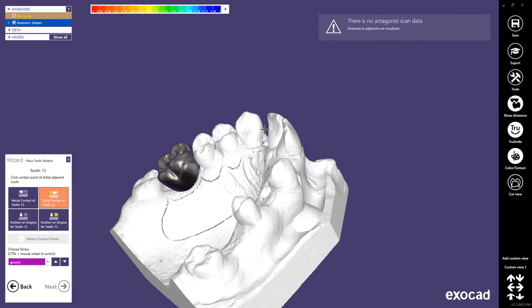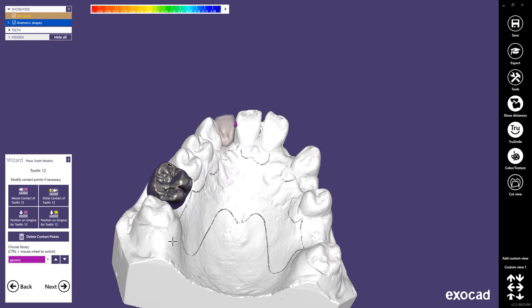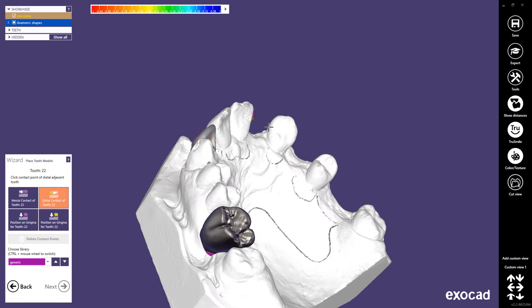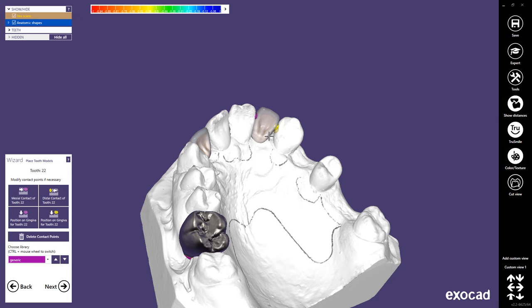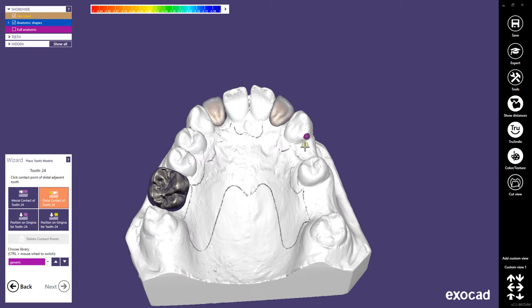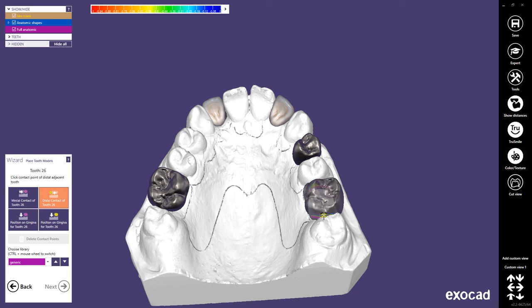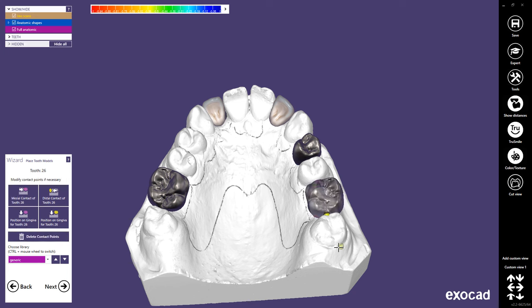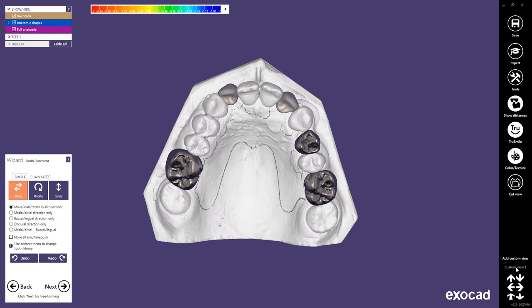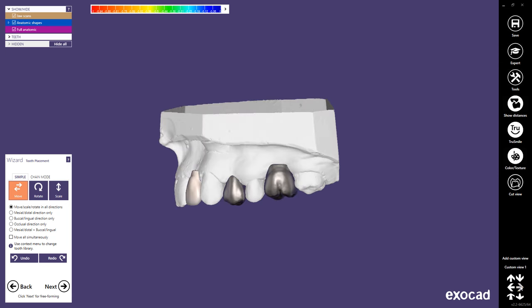Repeat this process until anatomic shapes have been placed for each edentulous area. In the following steps, you can adjust the position of the teeth as well as freeform the anatomy. In the tooth placement step, you are able to freely move the tooth models. Hold Ctrl and the left mouse button to rotate the tooth in all directions. Hold Shift and the left mouse button to scale the tooth. Hold only the left mouse button to move the tooth. In a separate tutorial, you can learn more about tooth placement and directional restrictions.